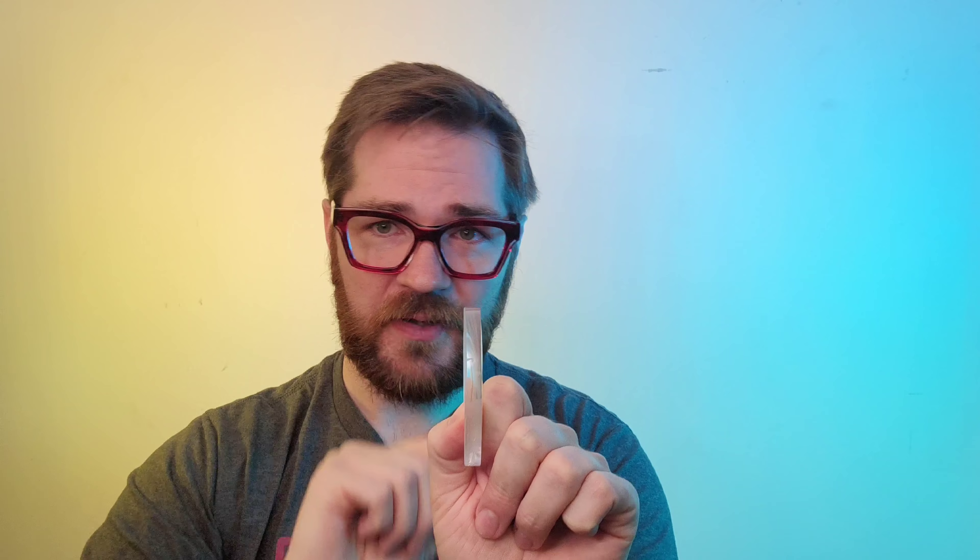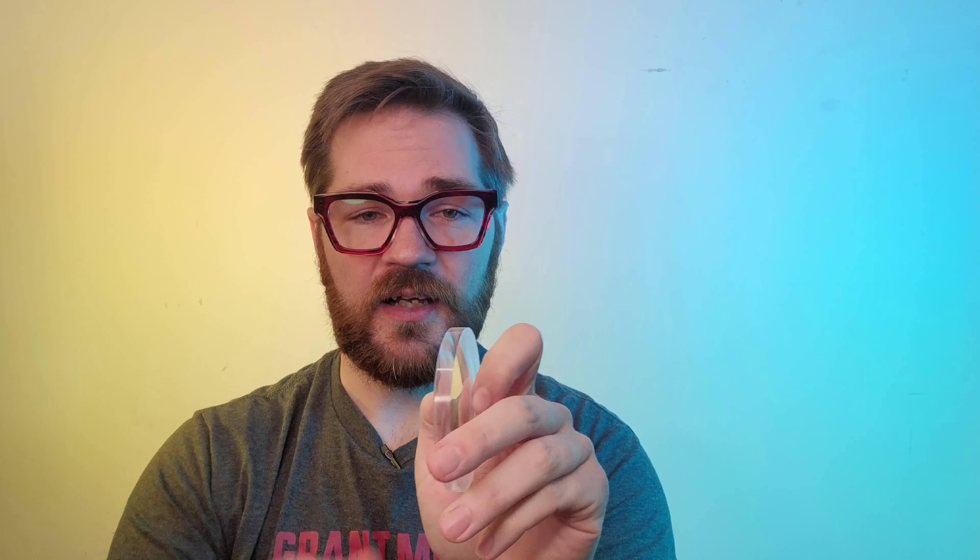With minus lenses you have a lot more room to play with bevel placement. If it's set too far forward, you'll get that little triangle bevel partially cut off and end up with the same problem. The triangle point of the bevel is what actually sits and holds the lens within the frame. If you sit it too far forward and truncate part of that front edge, you'll have more of the cut on the back versus the front. We call it a step bevel when it's intentional — we call it a shitty bevel when it's done on accident.